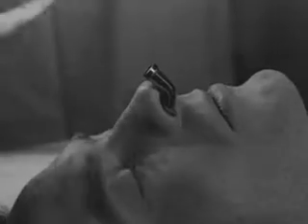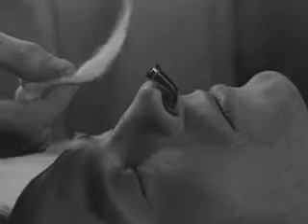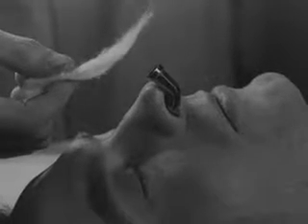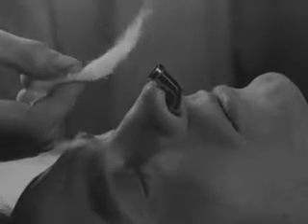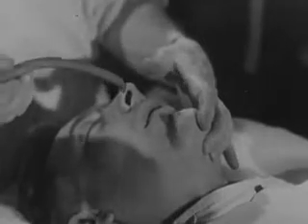After induction of anesthesia, the tube is passed along the floor of the nose until the breath sounds are heard at maximum intensity. The tube is then advanced during inspiration. Its presence in the trachea is indicated by full respiration taking place through the tube. Now the same process in slow motion photography.